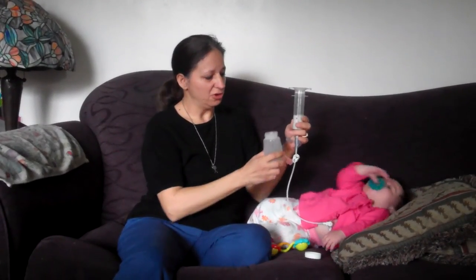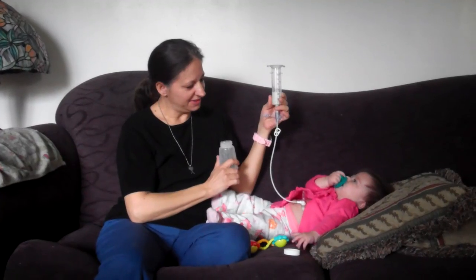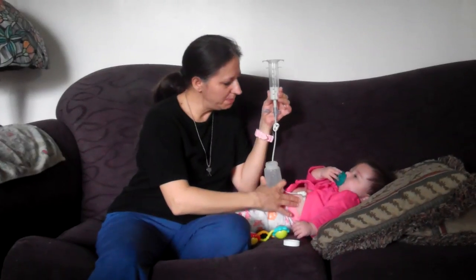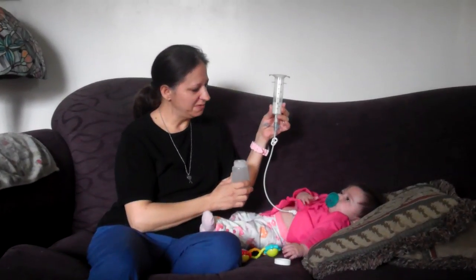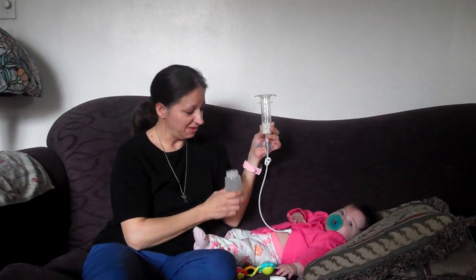And she's tired. Normally maybe I might have another pillow here. And she's very content. And now sometimes I'll explain to her how the milk is going into her belly and try to use certain words, make the connection for her. And I think she has it figured out, what this means, what's going on, because she knows that she gets full when she sees this.